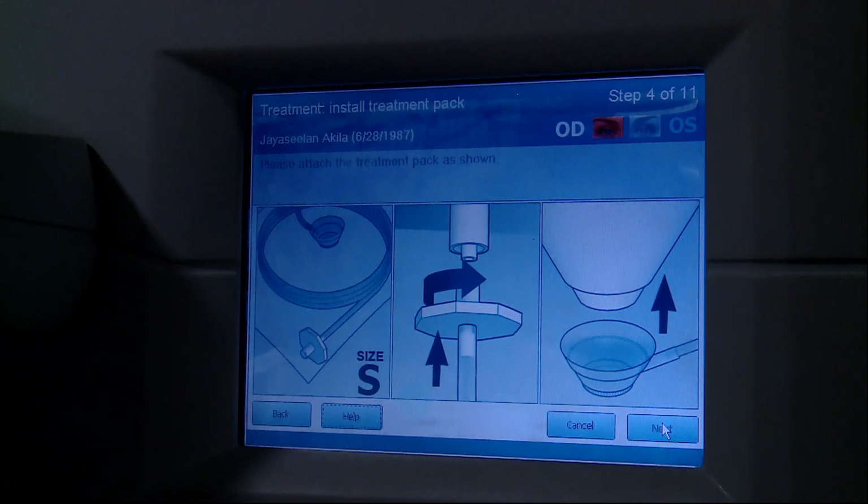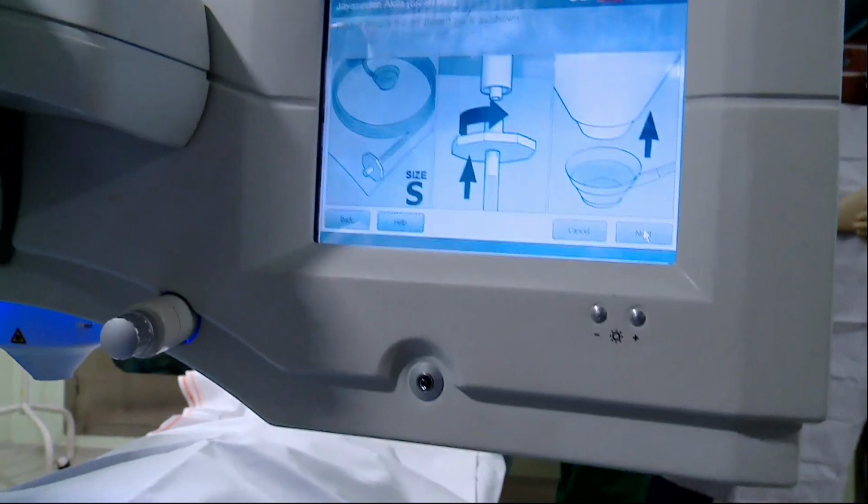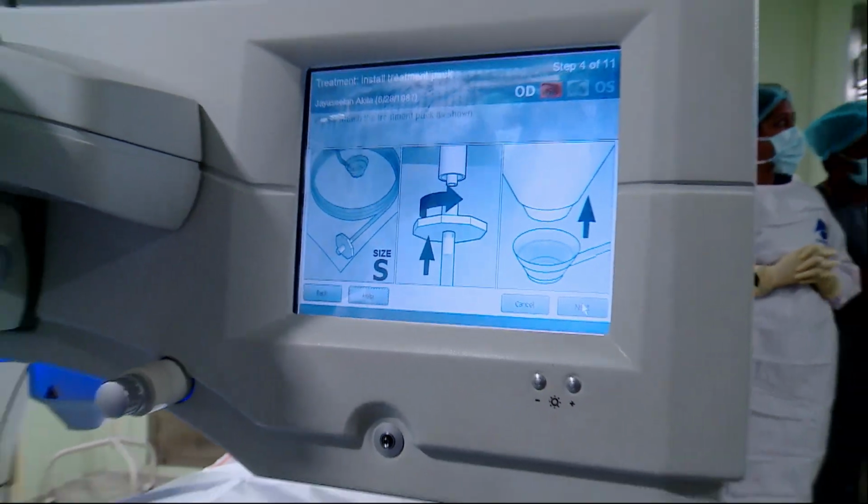Come, bring it here. We are going to attach the cone. Just come here. Yes, she is a pleasant young lady of 36 years. Come here, put this on. No, move a little back. Go back. The PIP has to change. Sister, you put this. Move back. Just go back.